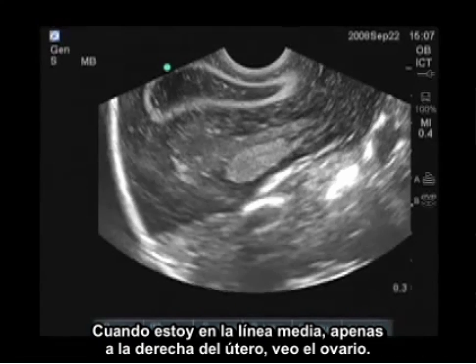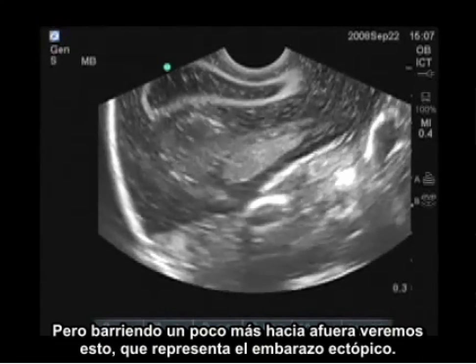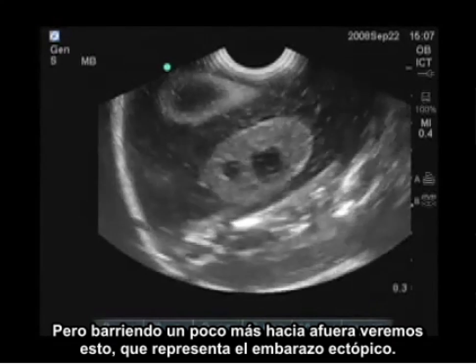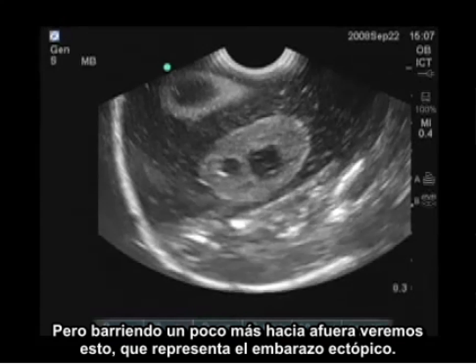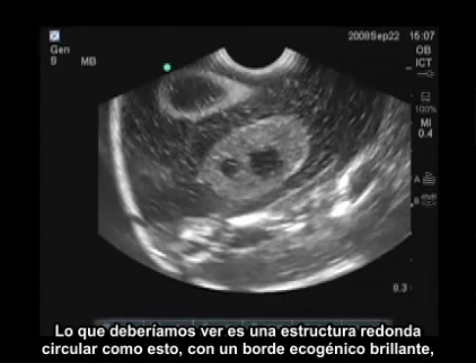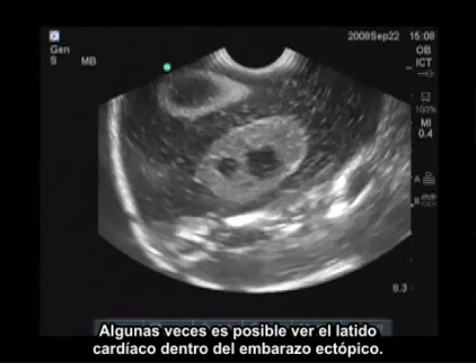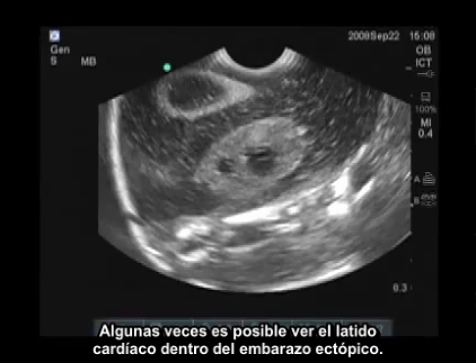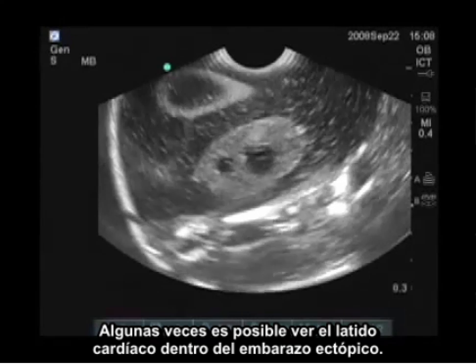When I'm medial, just right beside the uterus, I see the ovary. Scanning out a little bit more, this represents the ectopic pregnancy. This is what you should see: a round circular structure with a bright echogenic brim. It is also possible to sometimes see a fetal heartbeat inside the ectopic pregnancy.